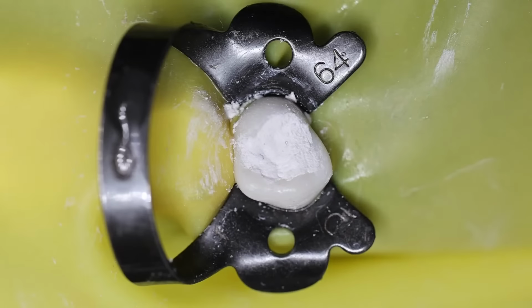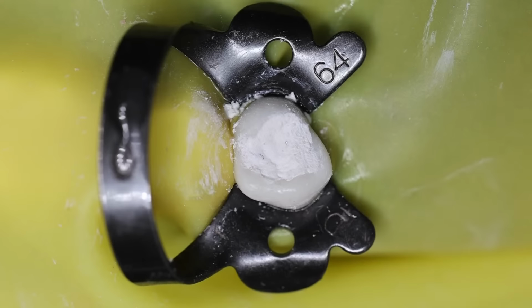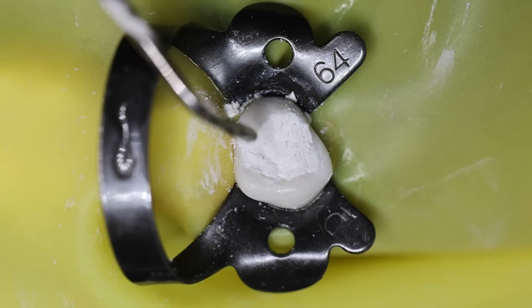So now what you have to do is call the patient after 48 hours. After 48 hours the MTA inside this cavity will set. You will remove this temporary restoration.